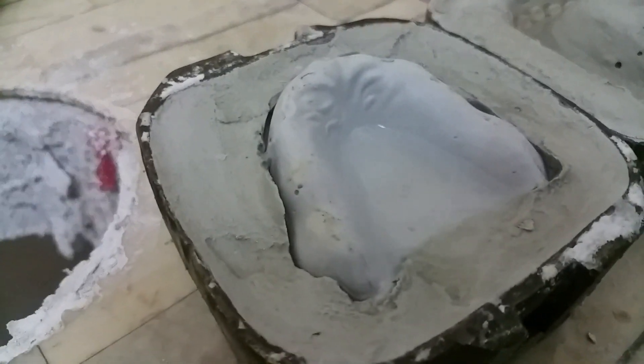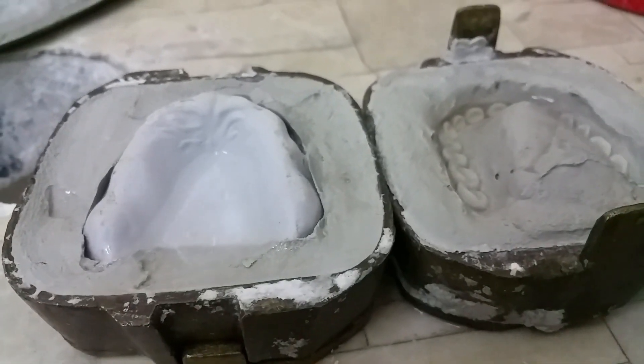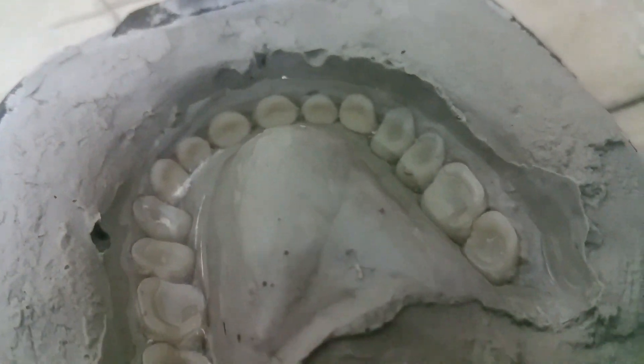For the acrylic stage, we start by isolating with a heat-activated isolator. Once we have applied the heat-activated isolator and waited for it to dry, the impression left by the wax in the gypsum is then filled with acrylic.